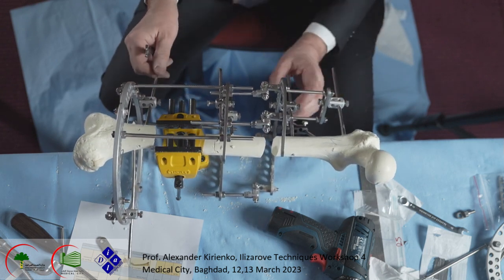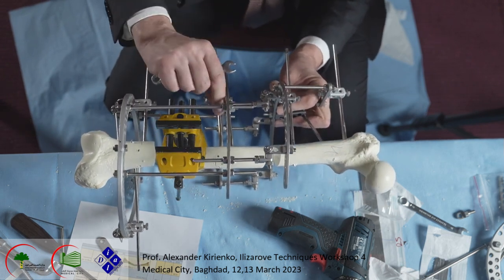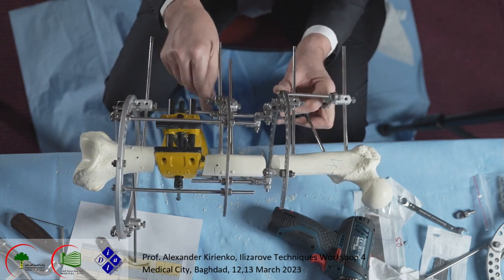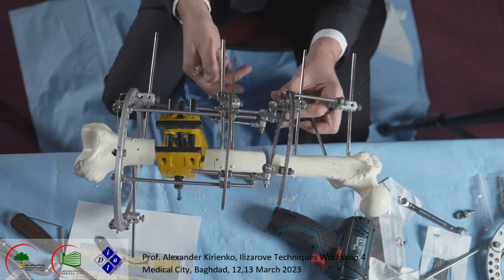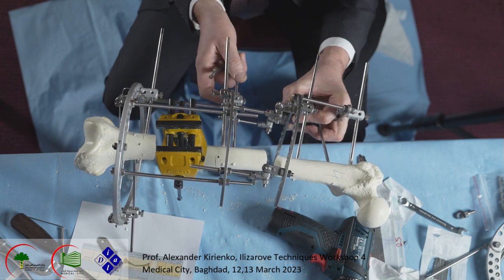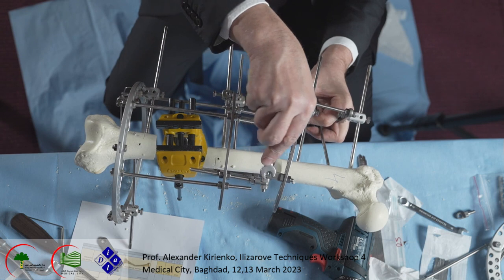What happens in real life? Because when we do lengthening, what happens? The proximal fragment goes into varus. There is always a tendency to go into varus. And if we look at the X-ray, it will be plus minus like this.